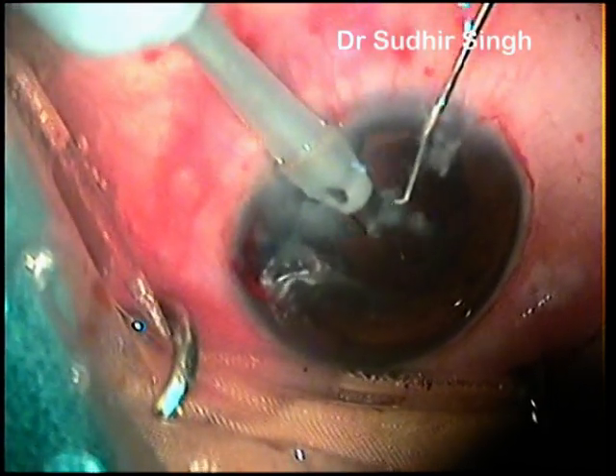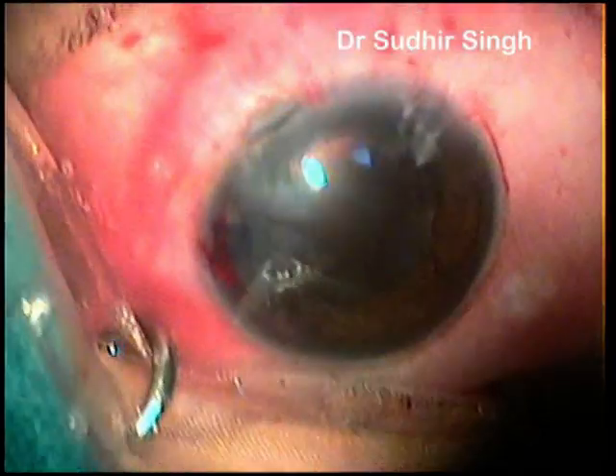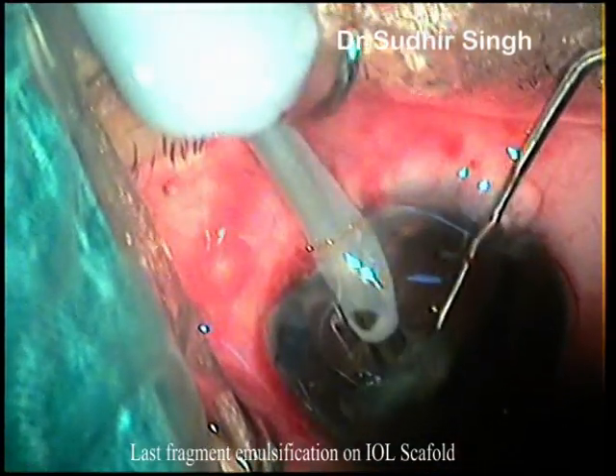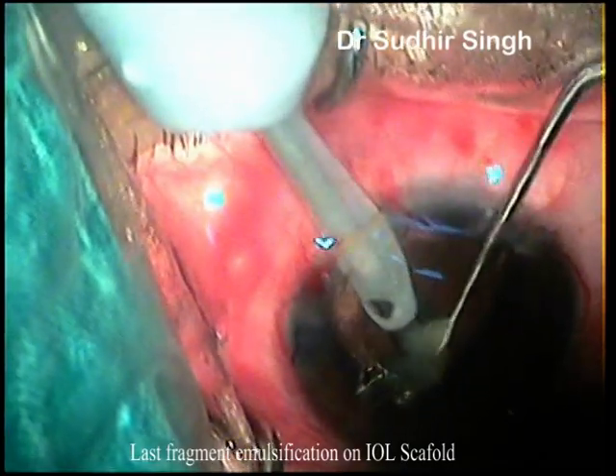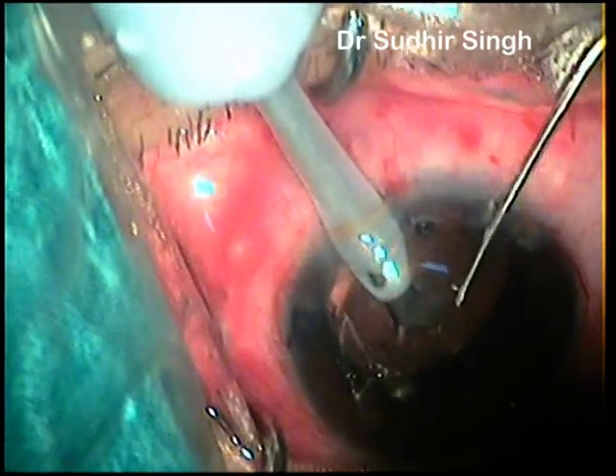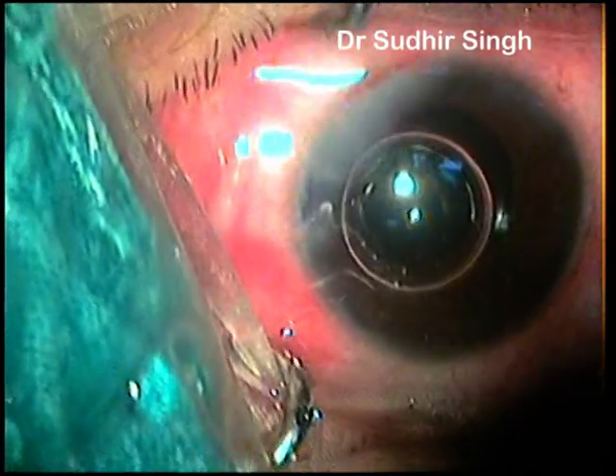The last fragment should be emulsified cautiously with step-down parameters. We prefer emulsification of the last one or two fragments after intraocular lens implantation, also known as emulsification under IOL scaffold. IOL scaffolding further increases safety.